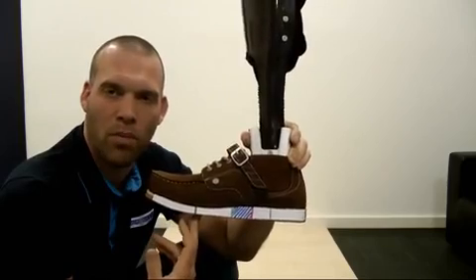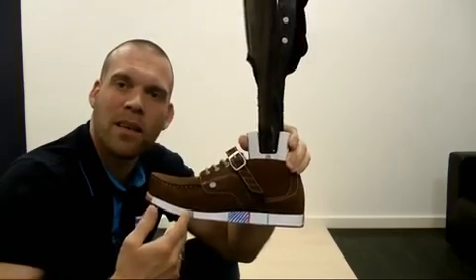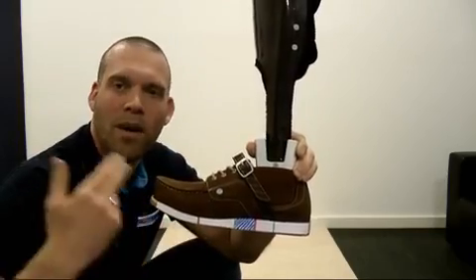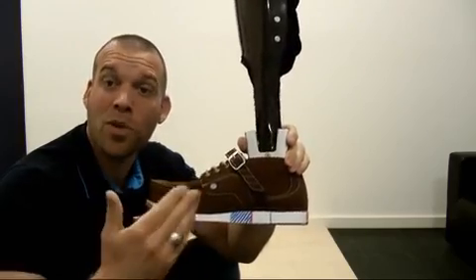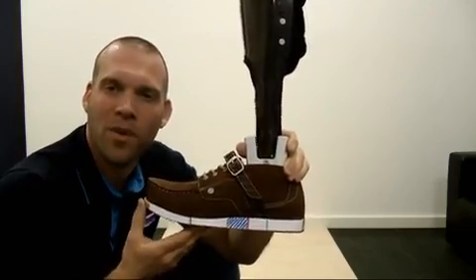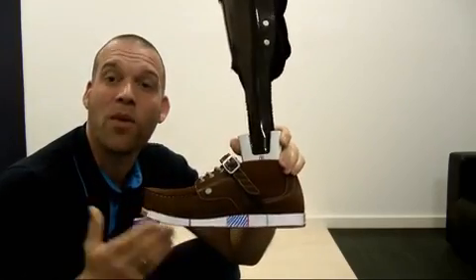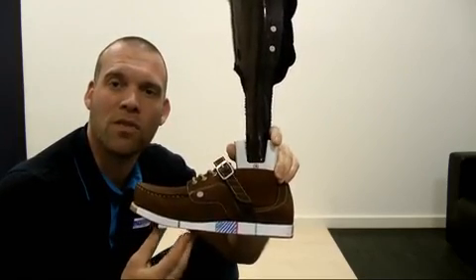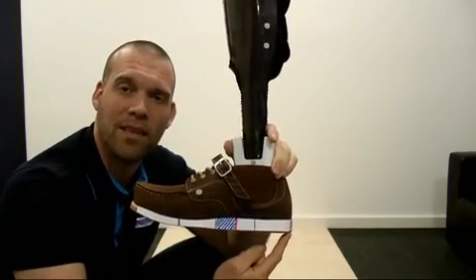This is the reason why we have to build in a toe spring in the orthosis. This is in order to create an ideal dynamic condition for our patients. If we were to build an orthosis for standing only, we would do it without a toe spring. But of course, we don't just build an orthosis for standing. We build it primarily for walking. For this purpose, it is important to understand that the supporting area that is available to us orthotists is limited between the highest point of the rolling area and the heel.